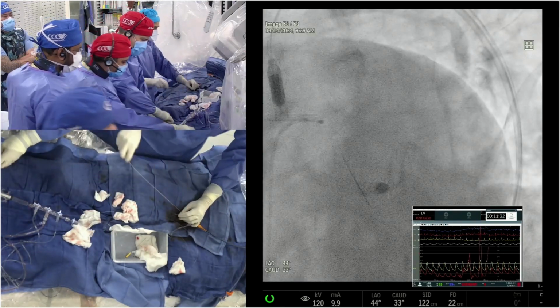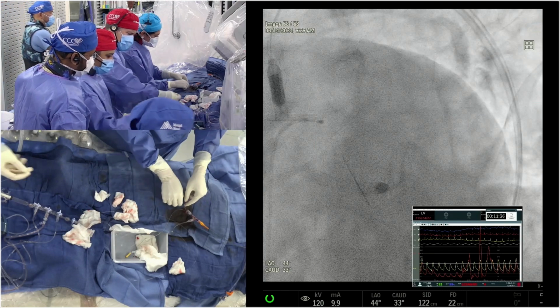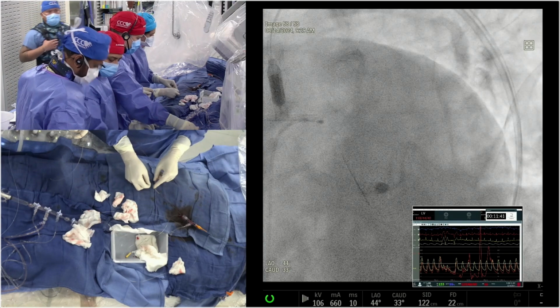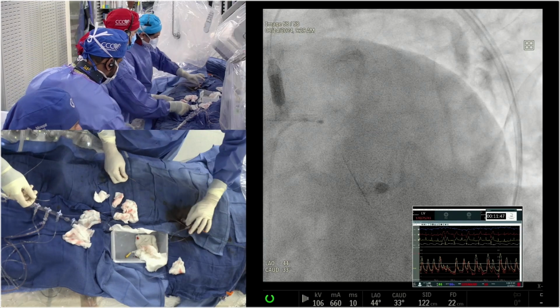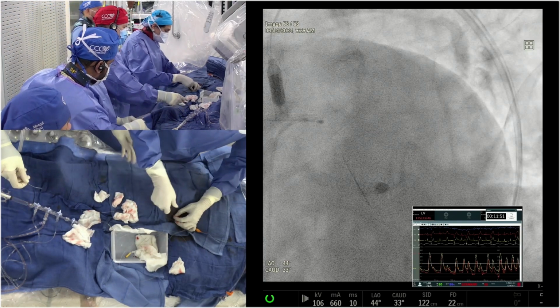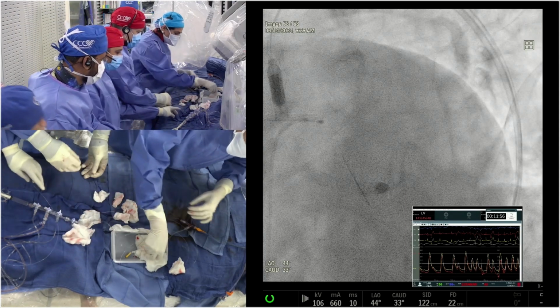Yes. And also my concern, which I said earlier when we first started, IVL of both sides. So if you did not have Impella and we're doing IVL of distal left main, ostial LAD, ostial circ, always we see this. I'll do a quick IVUS to show what happened to the nodule. And then I think plan 2 stent strategy here.